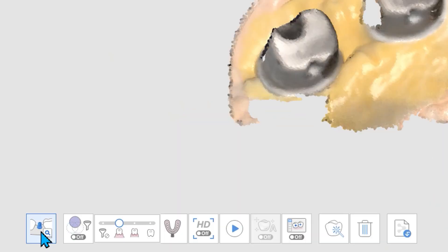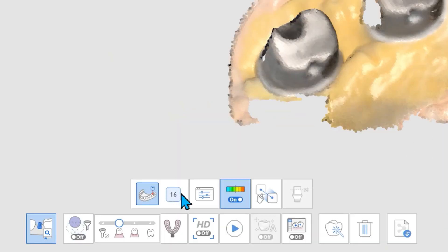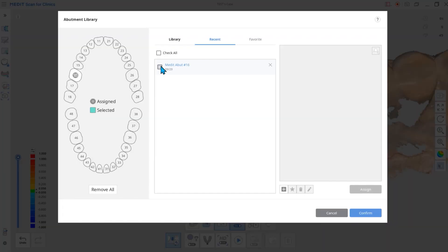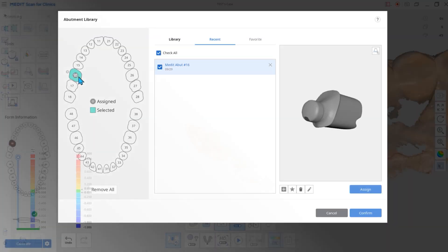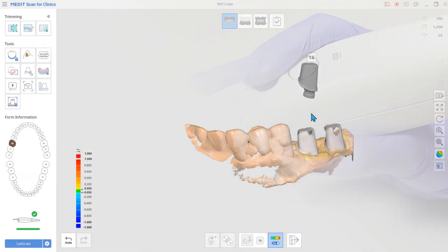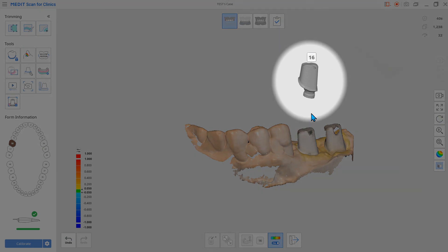Click AI Abutment. You can see the Assign Abutment library on the scan screen.